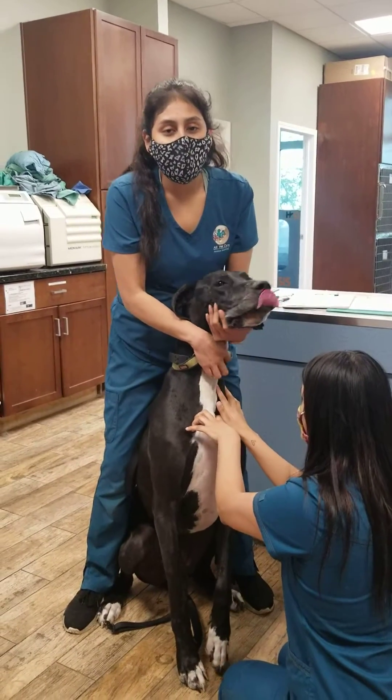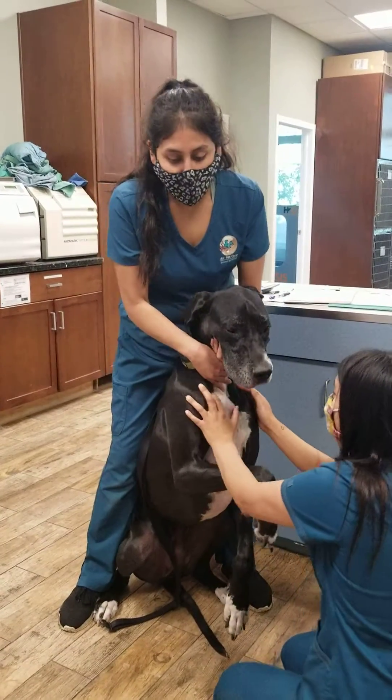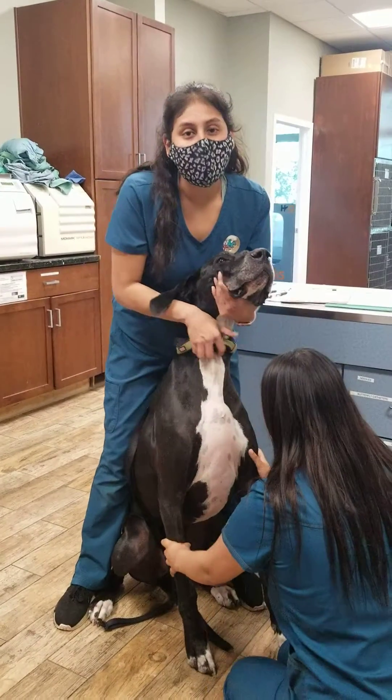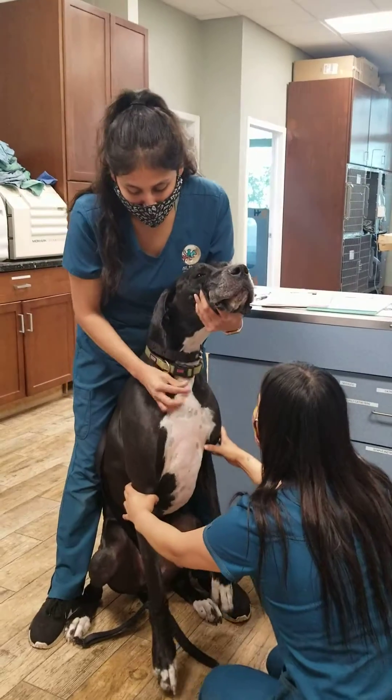My name is Jackie here at All Vet Care Animal Hospital. We're going to be doing a jugular blood draw for a Nelco comprehensive allergy test. This is Cynthia — she will be drawing the blood.